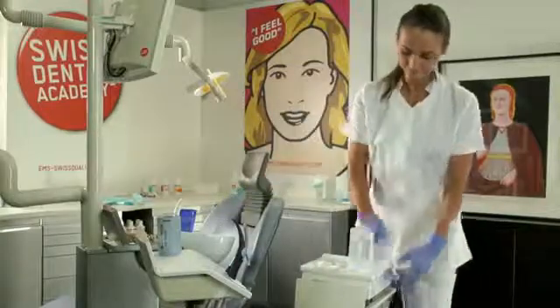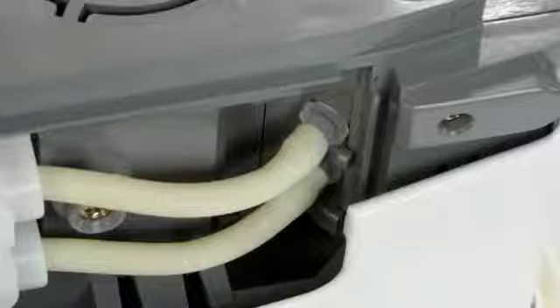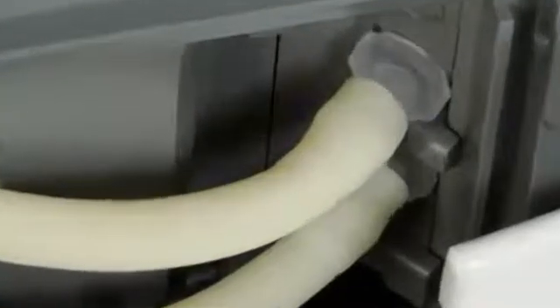Check that there is no water leak. If there is no leak, your unit is ready for normal operation. If there is a leak, check that the hoses are positioned correctly.